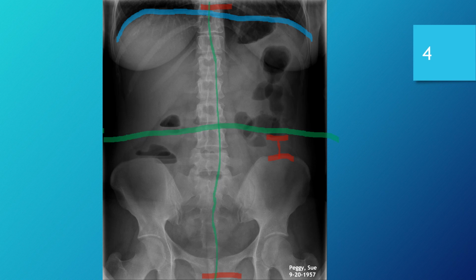So moving on to number 3, does the image demonstrate adequate exposure properties? The contrast on this is wonderful. It's excellent. The air fluid levels are readily visible. If we look here, we can identify some kidney margins, like right in this area here, and then I believe this is the presumed left side over here as well.